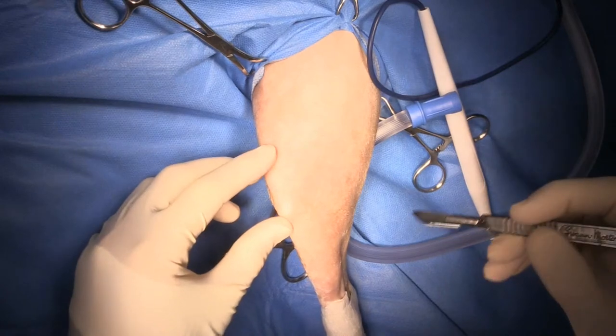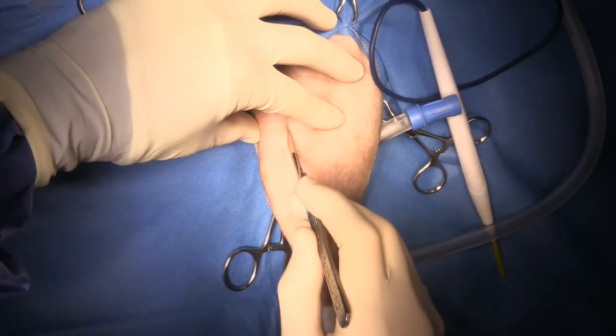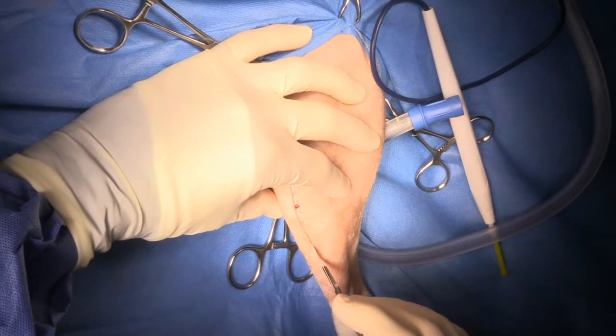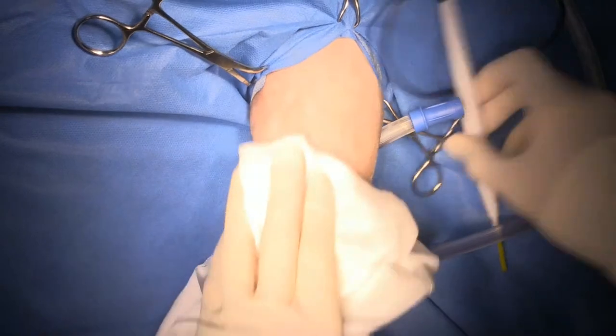As far as our initial skin incision, I usually use the tibial crest to the patella as the central third of my incision, so I'm going to extend it a third up and a third down from that. I go immediately para-patellar, just right alongside the patella tendon for my incision.